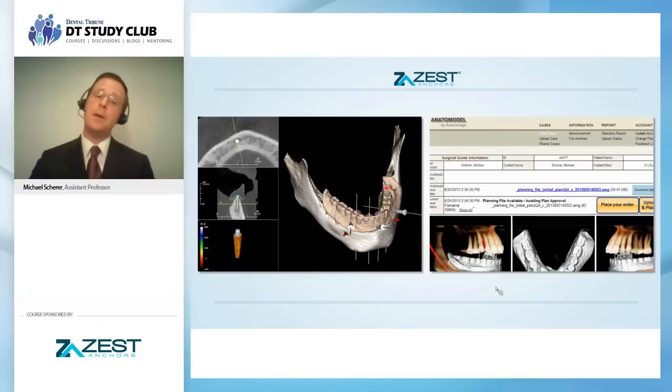And in this plan, we're going to be able to allow a virtual layer of the patient's existing complete denture. This virtual layer is going to allow us to manipulate different aspects of our treatment plan. We can then make sagittal slices, coronal slices, and best be able to make determinations based upon what we think we saw before and now.